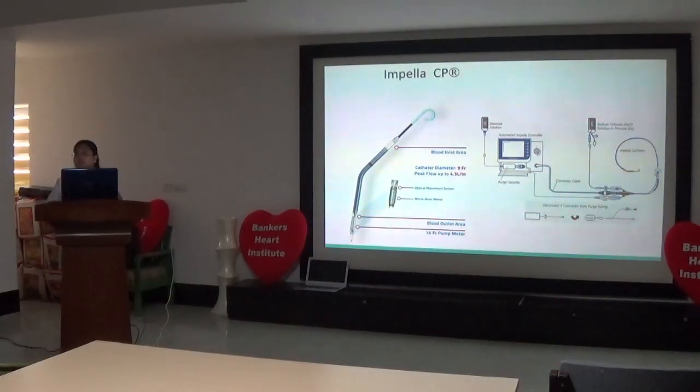Once we set a reference limit, the programmers select P1. The level of blood flow is labeled as P levels, so there are programs from P1 to P9, depending upon the flow and the reference limit that we have set. We can set that from outside. Like, suppose we want 2 liters per minute. That reference limit is set based upon the sensors present, from the pressure difference between the left ventricle and the ascending aorta. Depending on that, they will select the program.